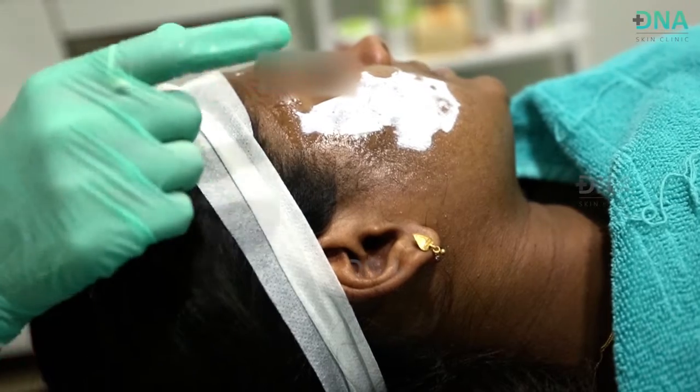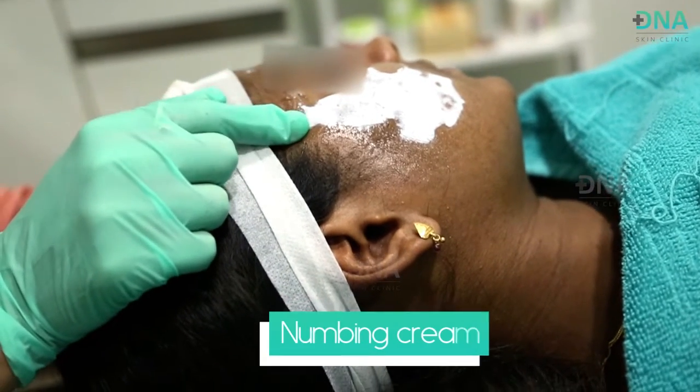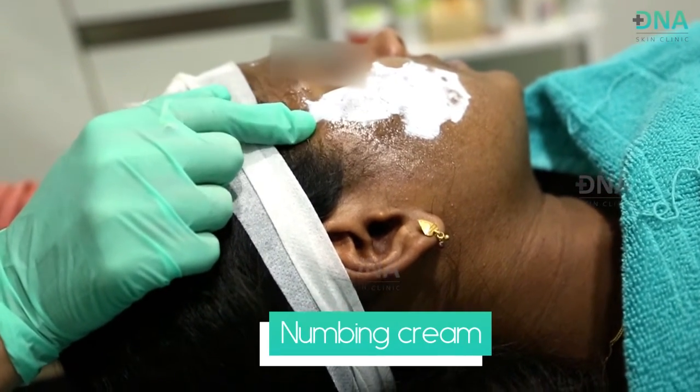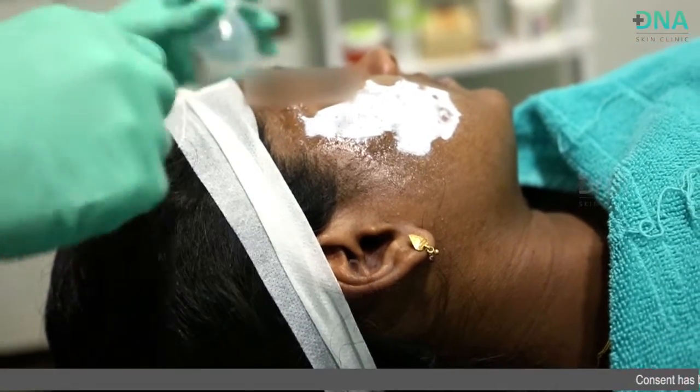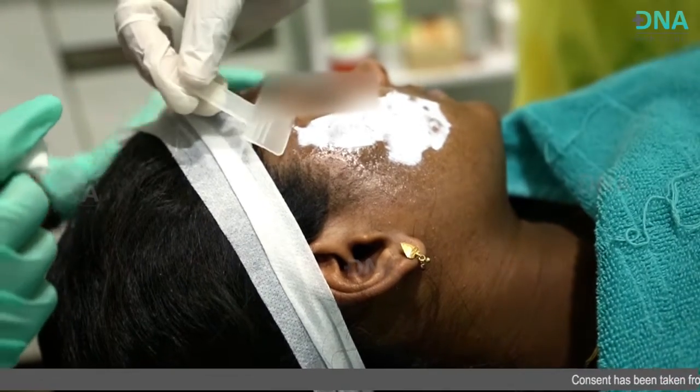As the first step, we have applied a numbing cream onto the area that has to be treated, and we have left it for about 40 minutes. Now we are going to remove the cream, clean the area and start the procedure.